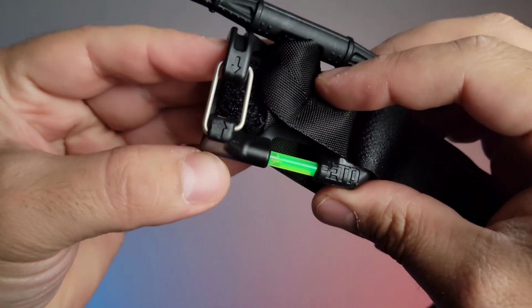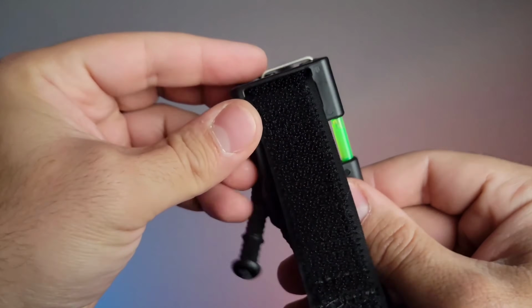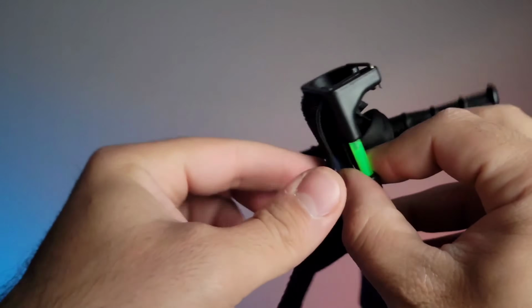On the right side of the tourniquet, there is a glow stick that pretty much when you start applying pressure, it breaks, and you can see it's already glowing now because I was trying it out. Personally, I don't see much value there because maybe it is able to glow, but if this is an everyday carry tourniquet, then it's mostly about being able to see it from a distance. So if they simply made the entire tourniquet orange, similar to the SOF-T Tourniquet or some CAT tourniquets that come like that, then I think orange as a bright color would be more beneficial than a glow stick.